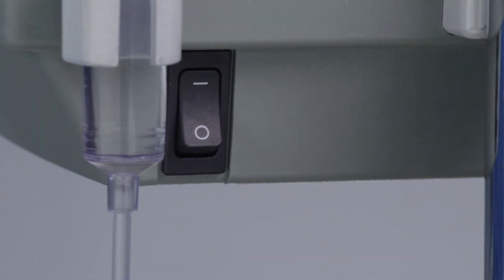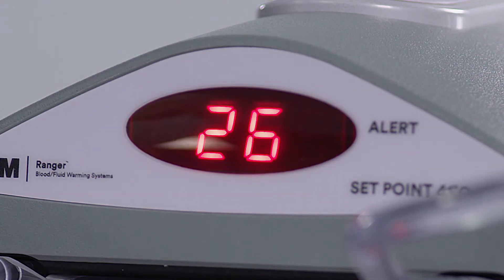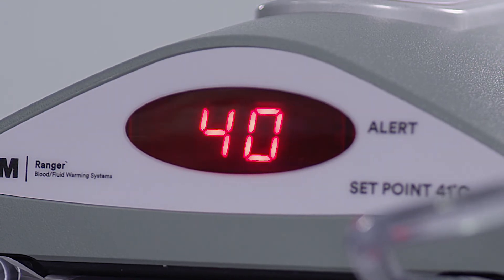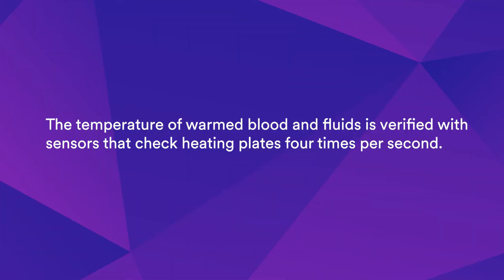Turn the warming unit on. On startup, the unit reaches its normal operating set point of 41 degrees Celsius in less than two minutes. The LED display located on the front of the unit displays the warming unit temperature. The temperature of warmed blood and fluids is verified with sensors that check heating plates four times per second.